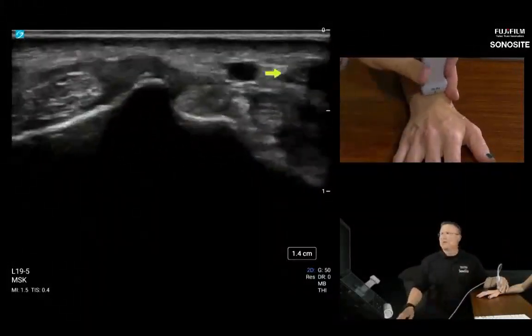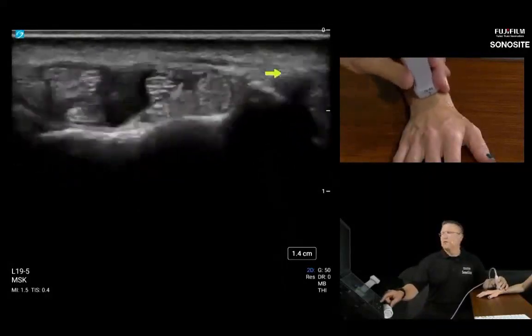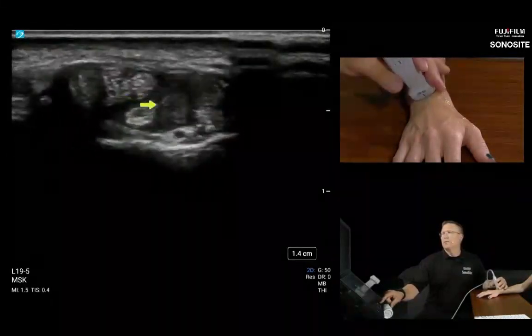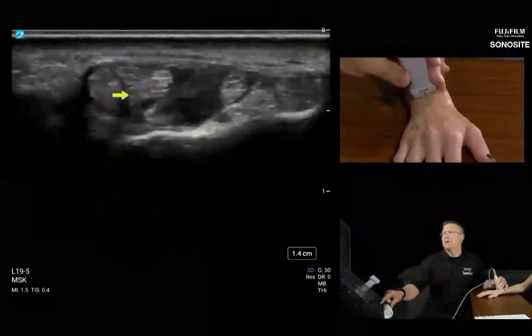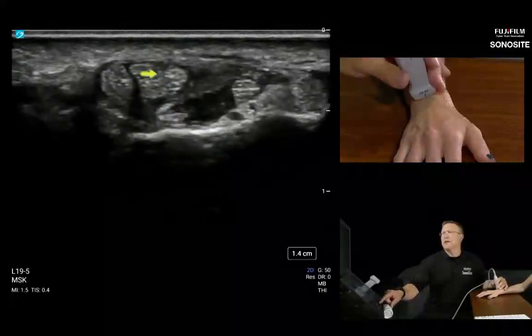All right, so let's flip the probe orientation. Let's leave compartment number 3 and its individual retinaculum. Let's go to compartment number 4, where we see the extensor digitorum and the indicis proprius. And then not mentioned in the slides is a neurovascular structure at this point.